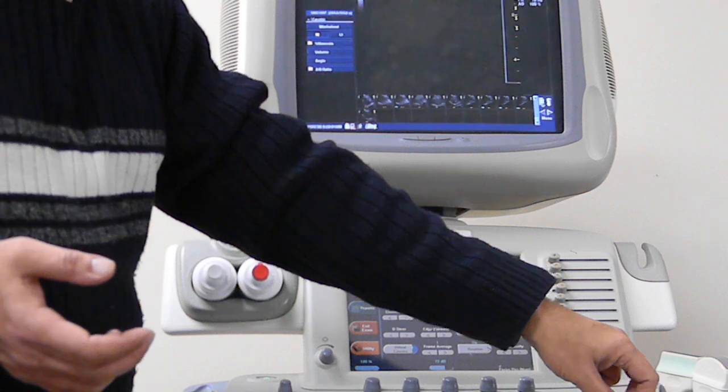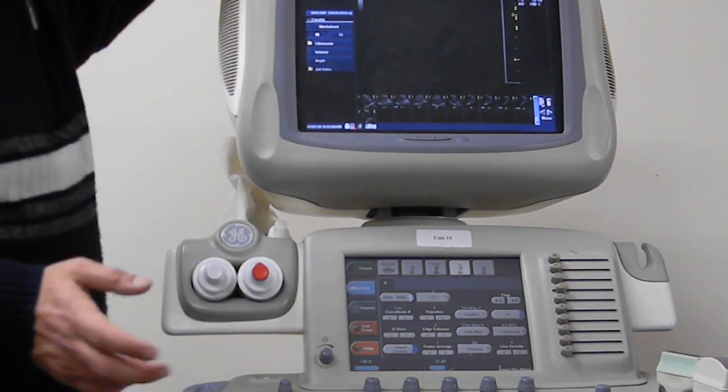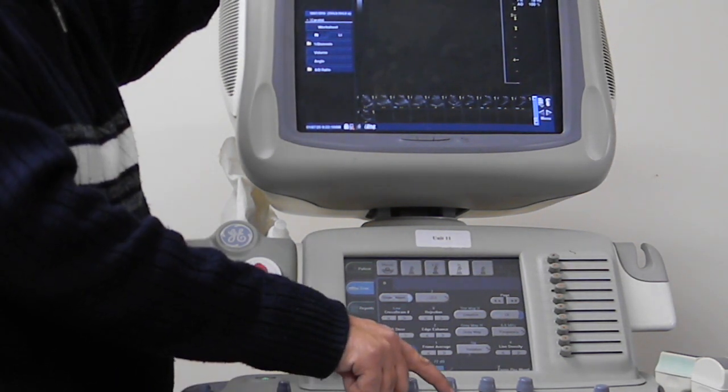Okay. Yes, what's next? M mode. Sorry, I was reading ahead. No, that's okay. So this one here is M mode.